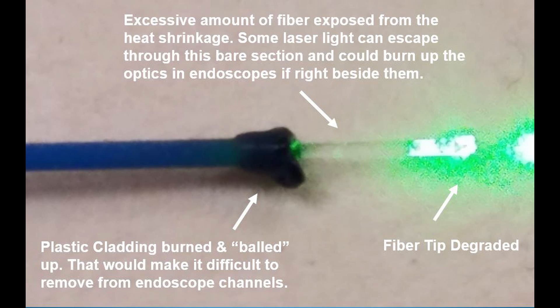The fiber tip still works but is significantly degraded, and then if you look at that plastic from the cladding, it's all balled up there. That by itself doesn't really hurt anything, but the problem is if you're using an endoscope it may be too large for the channel — it gets stuck in there and you have a hard time getting it out. This photograph is exacerbated because of the candy; it's usually not that bad with tissue in a regular endoscopic procedure, but this shows the point well.